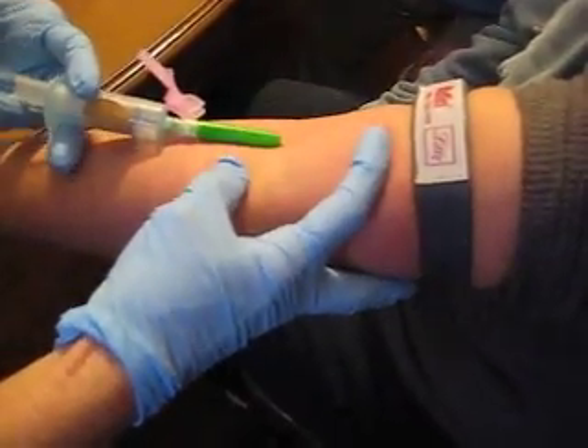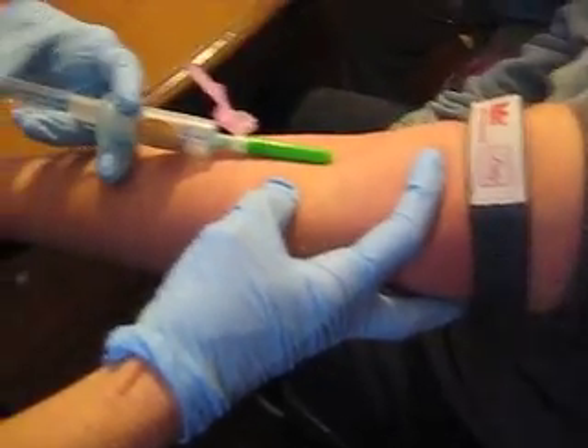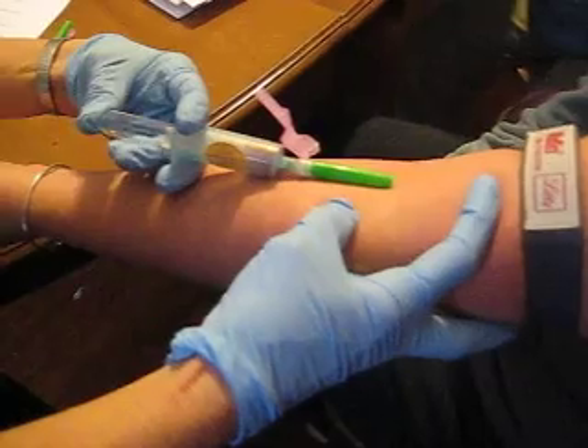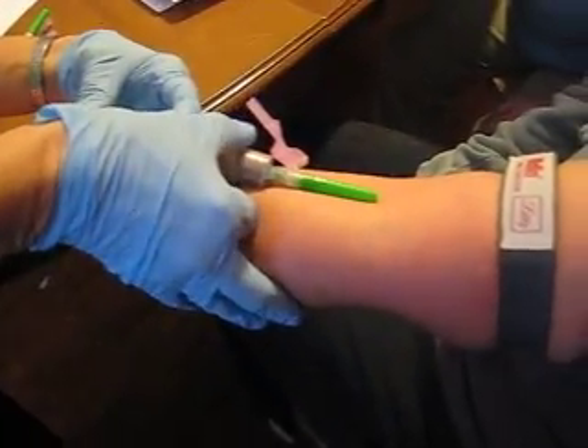I'll do the puncture. You go in at about a 15-degree angle — you'll feel it push. You should see a flash of blood in there. Just hold it and let it fill.